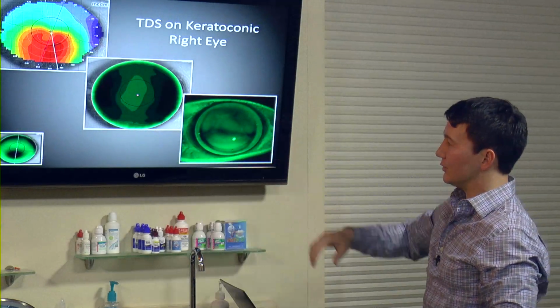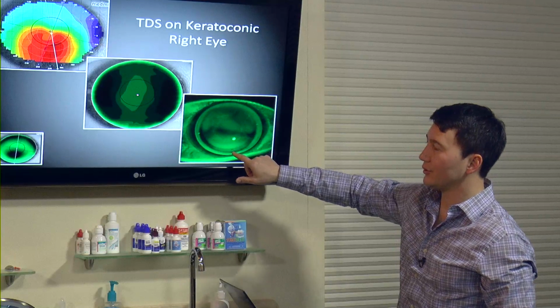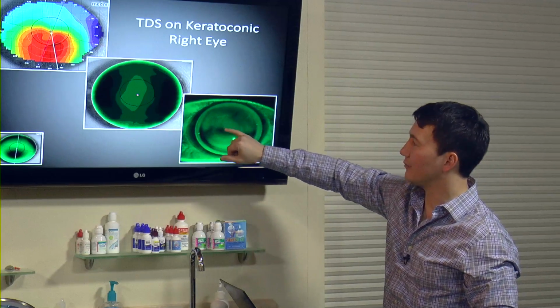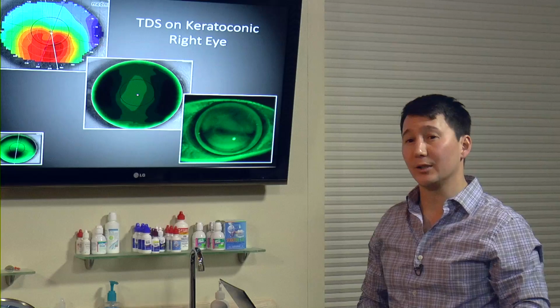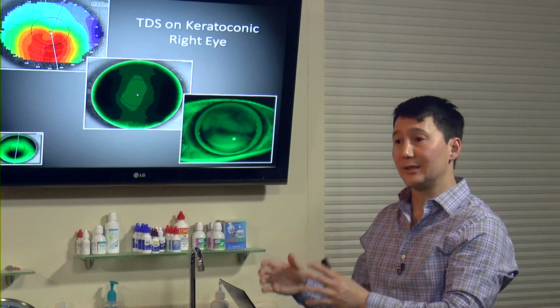So here's the actual lens. And if you've seen a lot of keratoconic patients, you rarely see a lens with a pattern that looks like this, where you have perfect landing at 3 and 9. You don't have excessive inferior lift or bearing over the cone. And if you fit steep enough to clear the cone, then generally you have excessive lift just superior of the cone. So at Pacific, we're kind of excited about this technology, that maybe this is the future of corneal GP lenses for the diseased eyes.